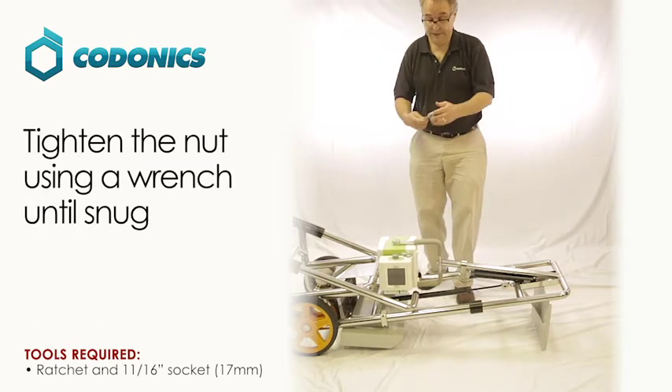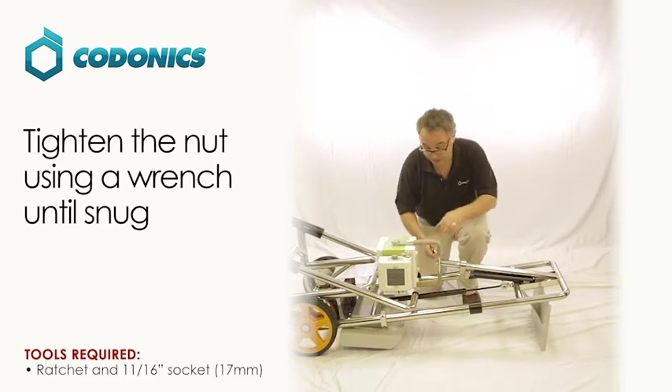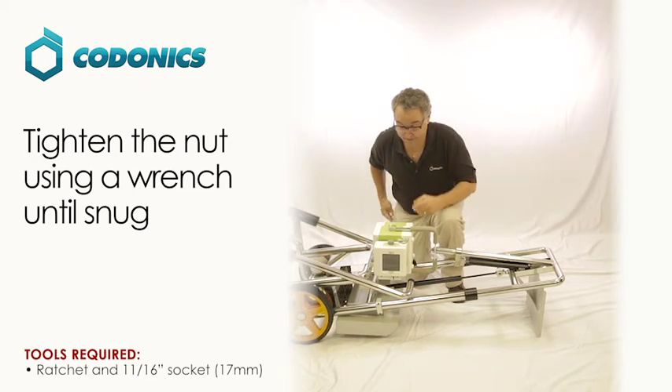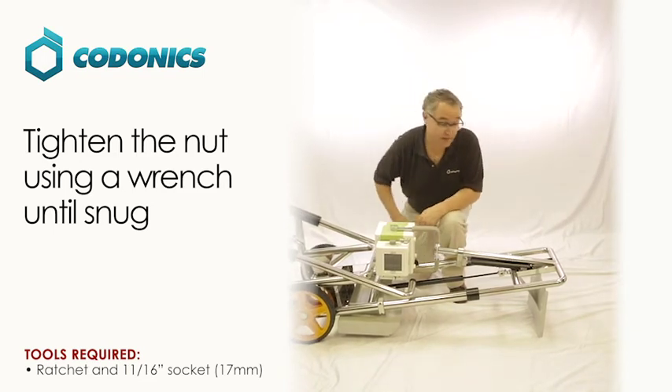Then take a wrench and tighten it the rest of the way so it's snug. Now you're ready to raise up your cart.